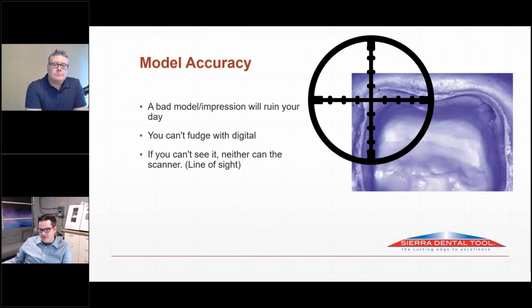And generally in my experience and Nick's experience, if you have a doctor that takes good impressions with polyvinyl, they're usually going to be pretty good at adopting that digital scan. And the opposite's true. If you have a doctor that's bad at polyvinyl, they're also going to be bad at digital. It's not really a catch-all. It's not a magic pill. So as a laboratory, you really still have to support them, even if it's digital, as far as how to actually do it correctly.